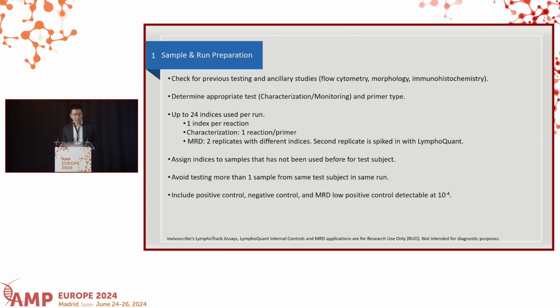The next few slides are a technical step-by-step procedure for the workflow. For setting up a run with samples, as discussed before, we check for previous testing and ancillary studies. We determine appropriate test type and primer type.